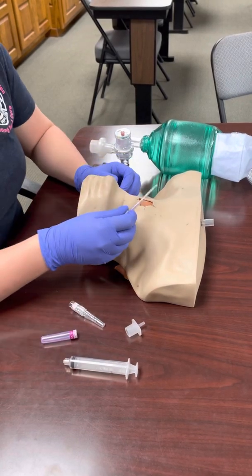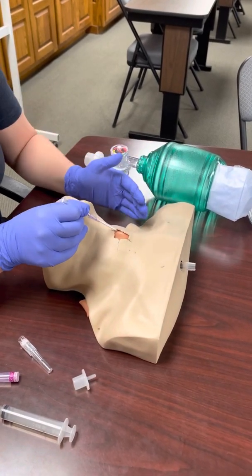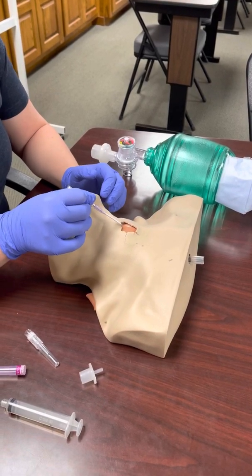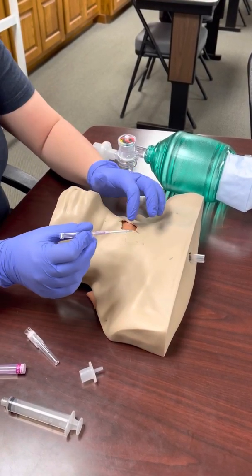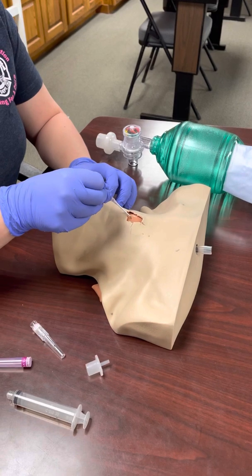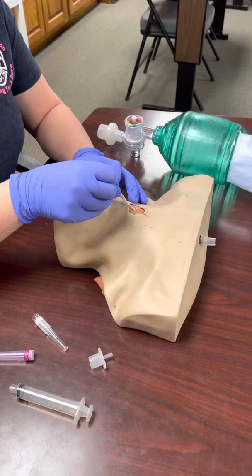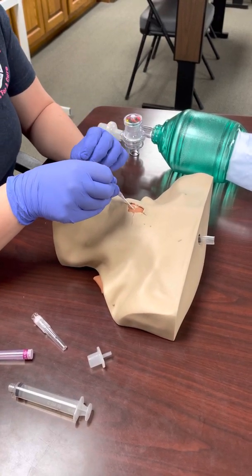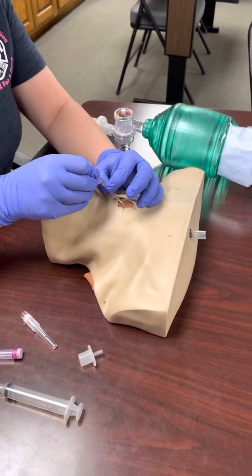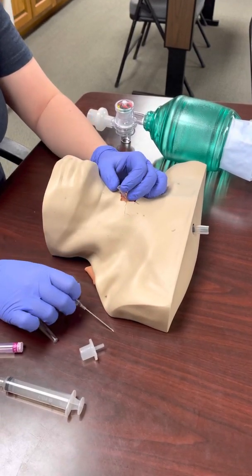With your 14 gauge needle, go at about a 45 degree angle — think about the trachea like a vein you're trying to hit. It'll make it easier to advance the catheter at that angle. I've found my landmark. Going bevel up on the 14 gauge, I'm going to puncture through that membrane. You should feel a pop once you're through the trachea — it's a thick membrane. Once you feel that pop, advance just a millimeter or two more, then advance just the plastic catheter forward and pull the needle out, just like you would for an IV.